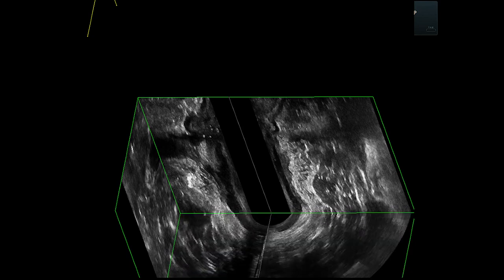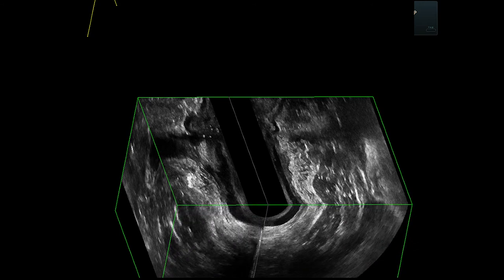Now look at this. This is the wall length of the anal canal. You see the internal sphincter here, okay? So this is the external sphincter, and then the puborectalis is coming here. So my idea or my advice for you is that maybe you can go through the intersphincteric plane. If you go through this plane, you can reach the cyst. And so you avoid going from inside, and you just go through the intersphincteric plane, and just at the level of the puborectalis, you will find your cyst.